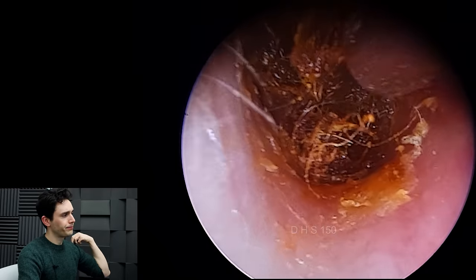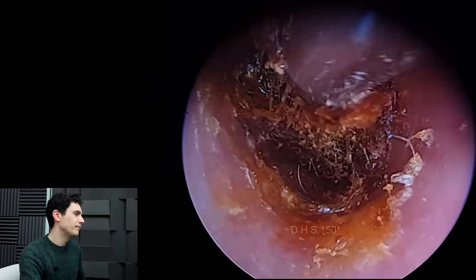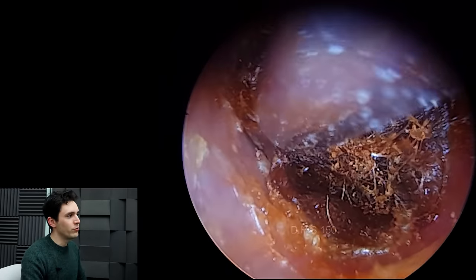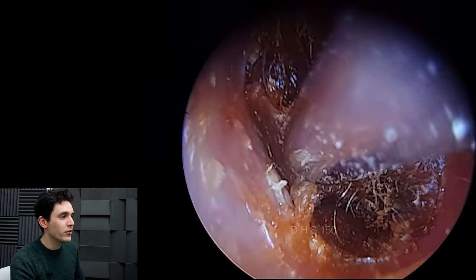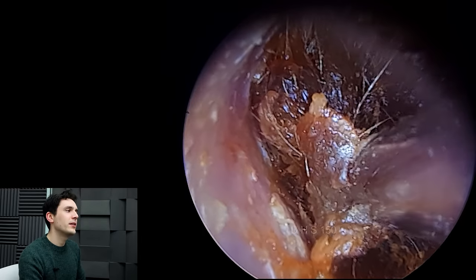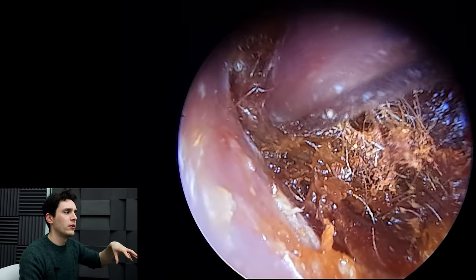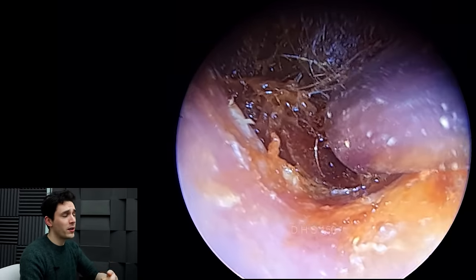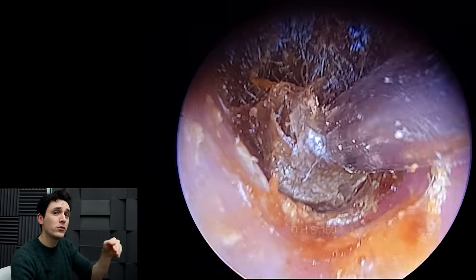Because this ear is so painful, I was quite nervous to use the irrigator. We all hear about the downsides of syringing the ear — irrigating with water for fear of perforating the eardrum. Realistically, I've never actually heard of that happening to a colleague. I've heard of it happening to patients, but only with the old school methods where they used the big metal syringe and literally pumped water into the ear at a dangerously high pressure. The machines we have now, at least in the UK, are electronically driven. You can increase the pressure if you want to, but for the most part, most people keep it on a low pressure and aim the stream of water upwards at the roof of the ear canal, not directly at the eardrum.